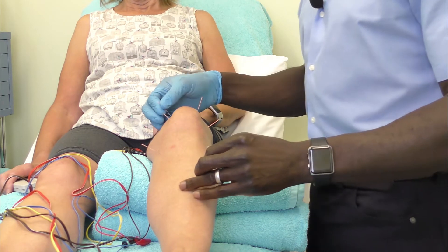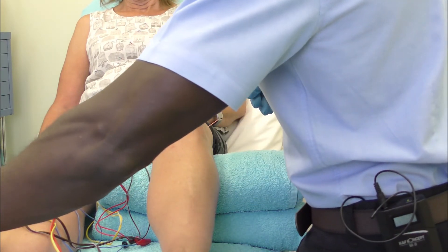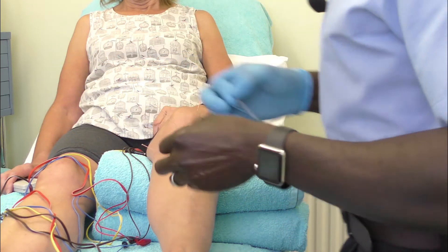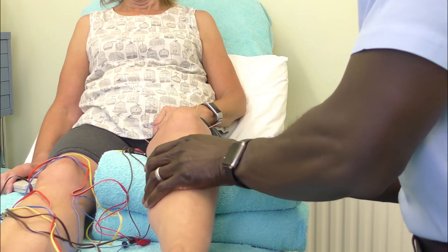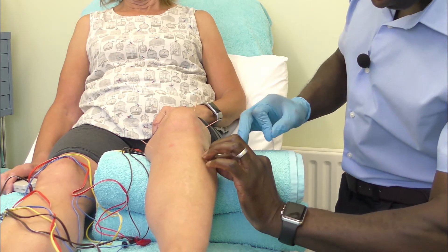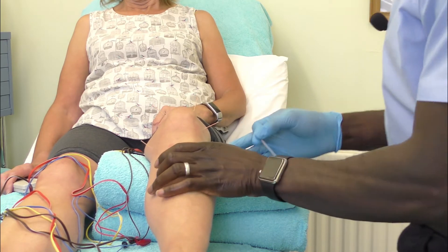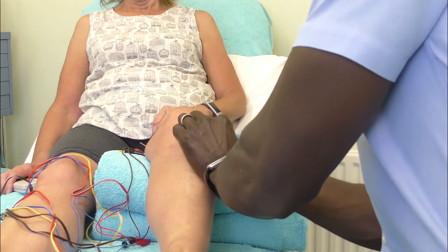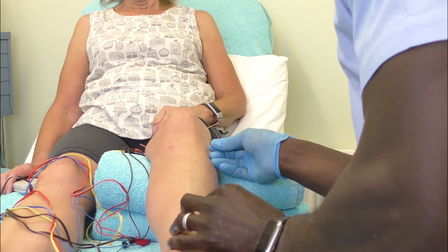These are going to be your main points segmentally. You can now also utilize another common point — Gallbladder 34. Find the head of your fibula, and just needle away from the head of the fibula.